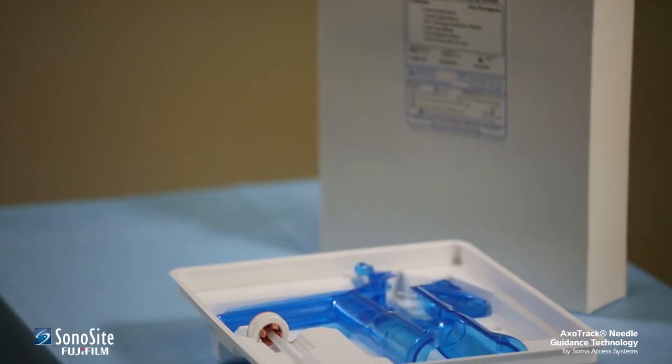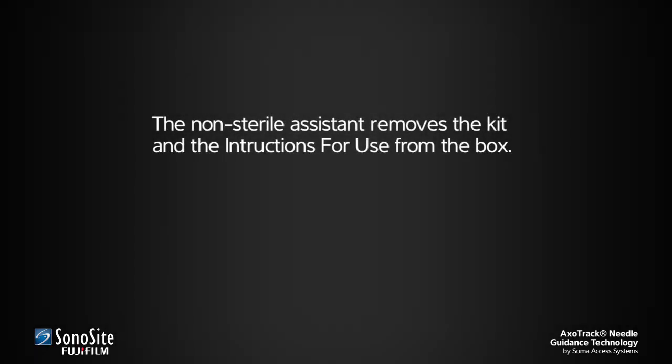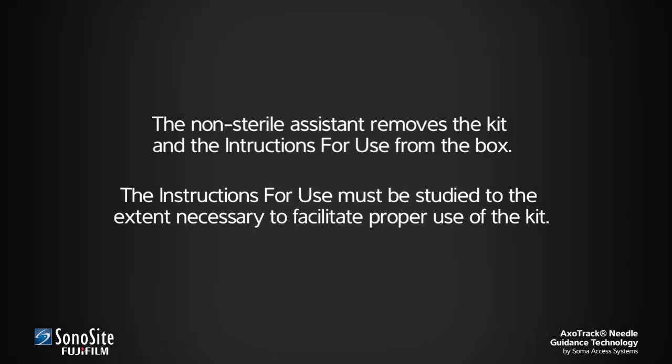Assembly of the transducer shield is simple, but requires care to avoid contamination of the sterile field. First, the non-sterile assistant removes the kit and the instructions for use from the box. The instructions for use must be studied to the extent necessary to facilitate proper use of the kit.